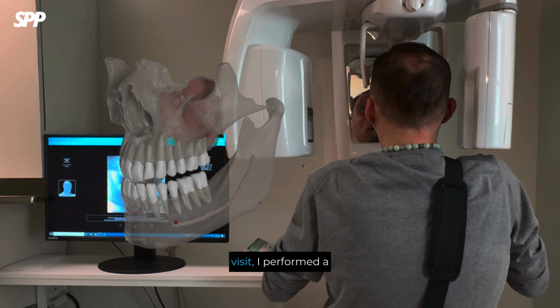On the patient's first visit, I performed a CBCT scan after the consultation. If you are using a small FOV CBCT machine, the sinus area must be included in the scan for maxillary cases. For a mandibular case, the mandibular nerve must be included. This is essential for safe and accurate treatment planning. Of course, if a sufficiently large FOV is available, it is recommended to include all relevant anatomical areas in the CBCT scan. After that, I performed an intraoral scan.